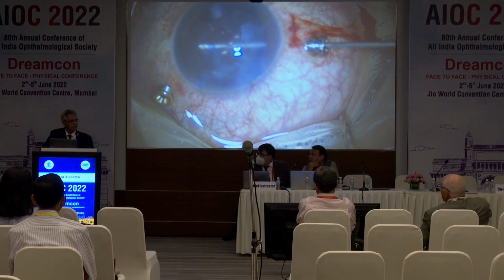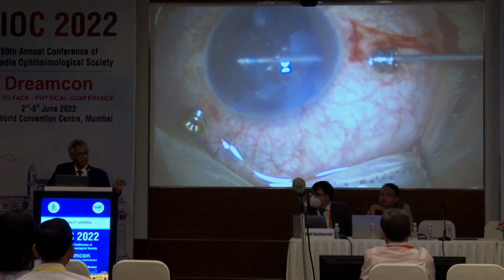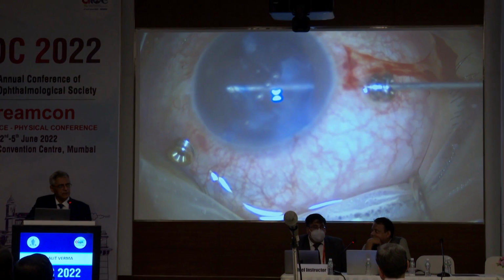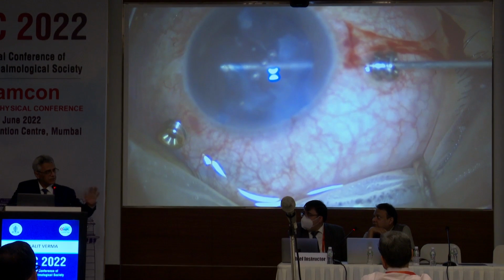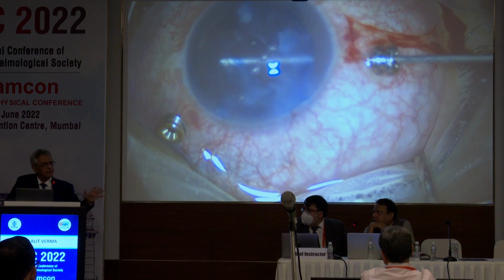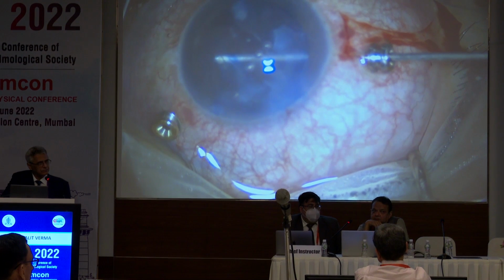We leave behind a steroid inside the eye, unless you are unlucky for endophthalmitis, but by and large, this will aid in controlling inflammation and reduce the chances of CME also. So in all retinal surgeries also, once we stain the posterior hyaloid, we deliberately leave behind some crystals of triamcinolone. And I see that you didn't use triamcinolone when you did it from the pars plana. Not required.